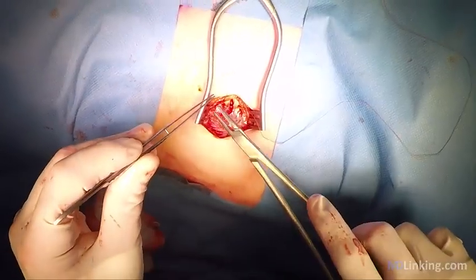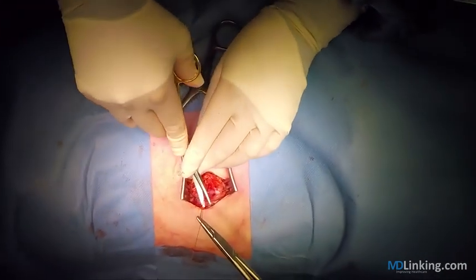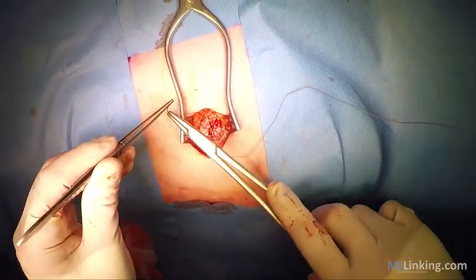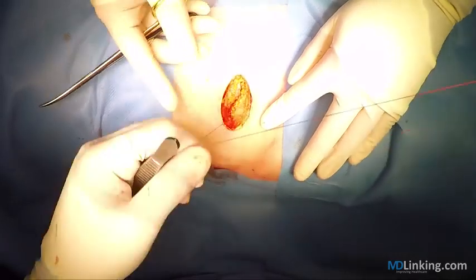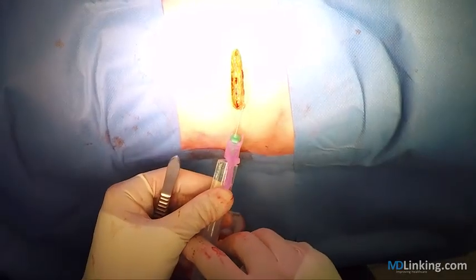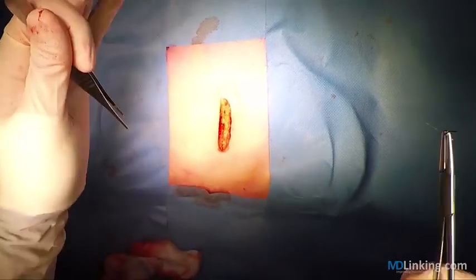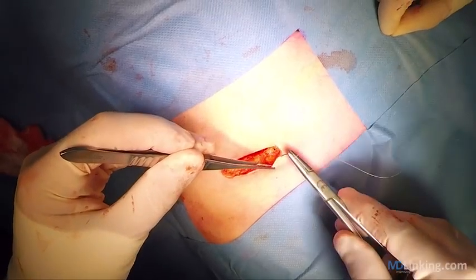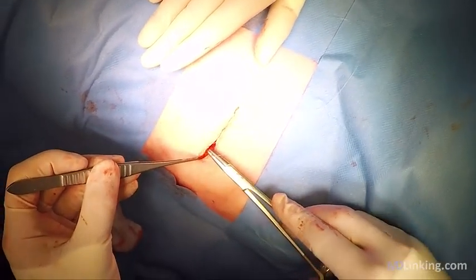It's not necessary to close the peritoneum, but it sometimes helps to keep the abdominal content inside while closing all layers. For post-operative pain reduction, you can decide to inject the wound with a local anesthesia. We then use an intracutaneous running suture to close the skin.